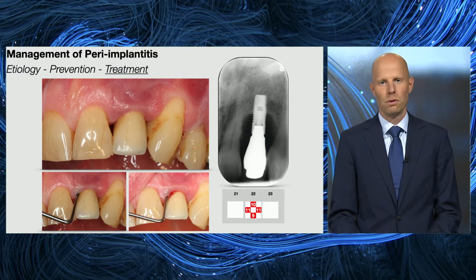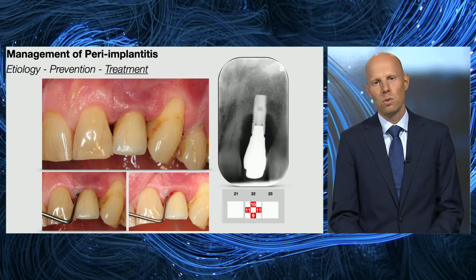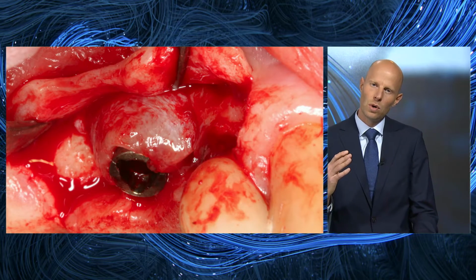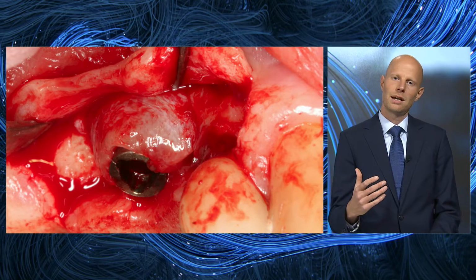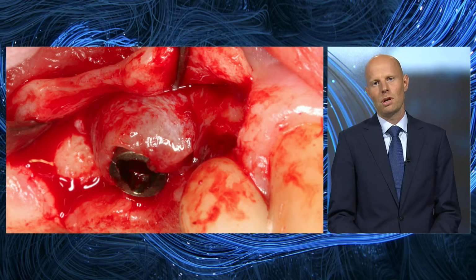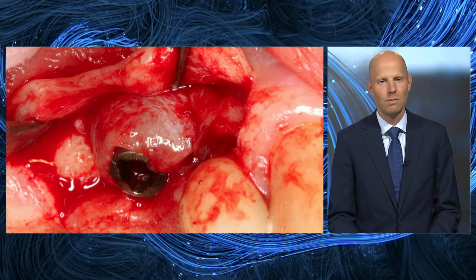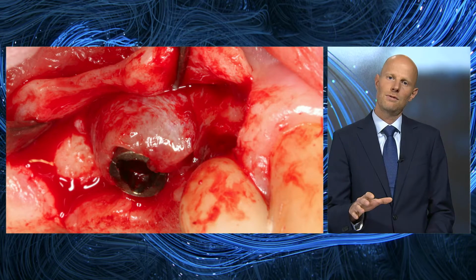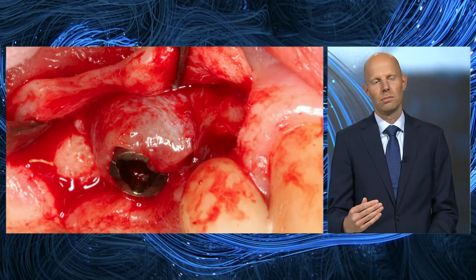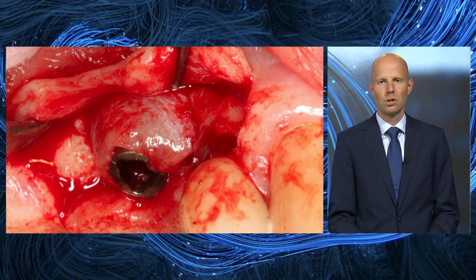We create full thickness flaps, so it is very much a periodontal therapy, with one particular difference indicated on my next slide. What is possible in the peri-implantitis situation is to raise the flap and immediately separate the inflammatory lesion from the flap. So what you see here is the lesion remaining in the defect surrounding the implant, but I have elevated a clean flap. This will facilitate your treatment and speed up the process.